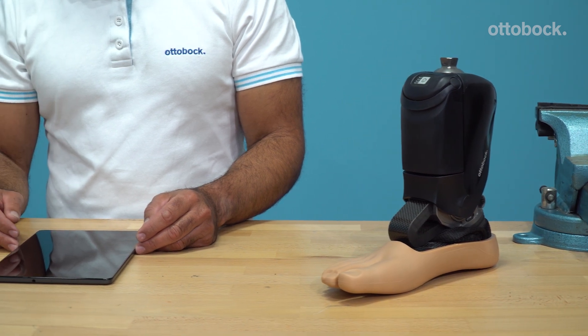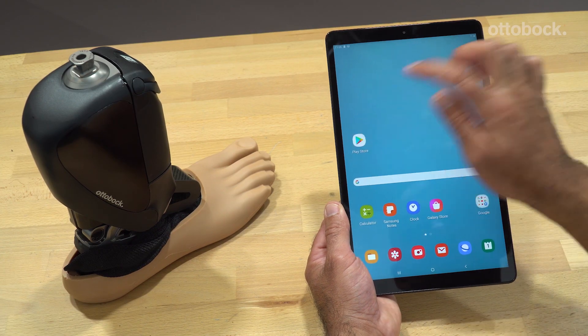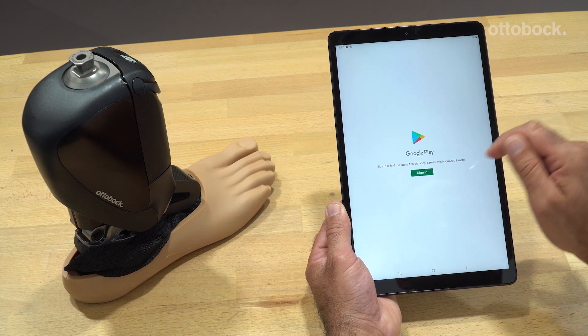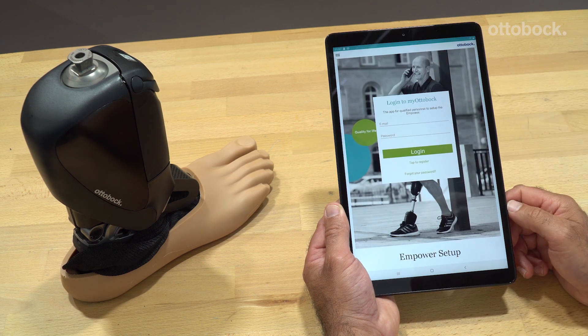To adjust the Empower, you need the tablet with the installed Empower setup app. To start, please download the setup app from the Google Play Store. Currently, it runs only on Android devices. The app guides you through the prosthetic alignment, including the dynamic optimization. Please connect to the app to verify proper alignment.